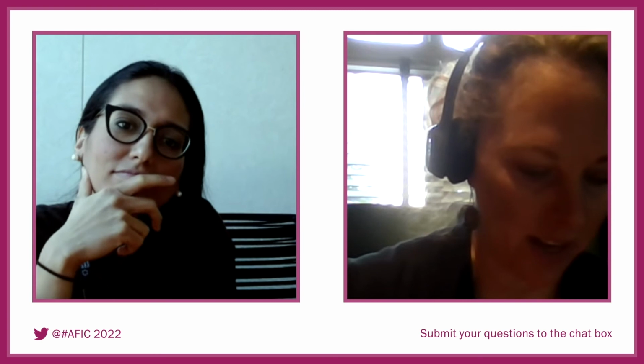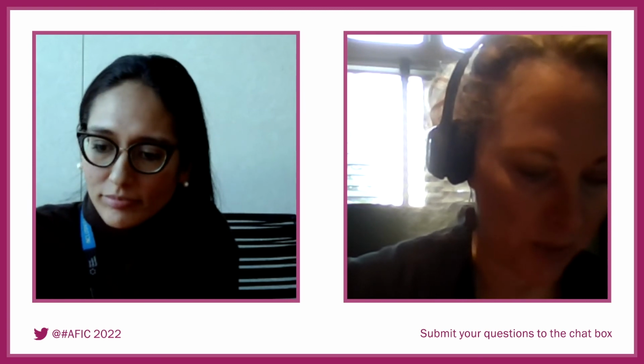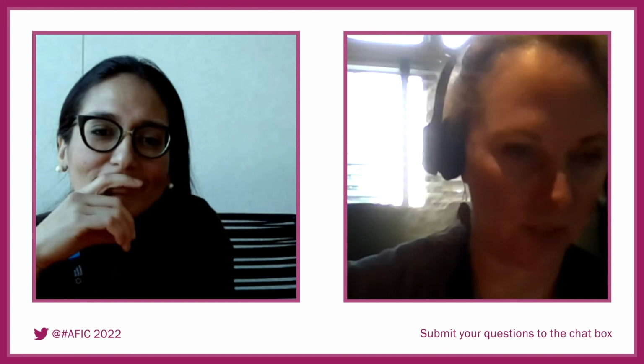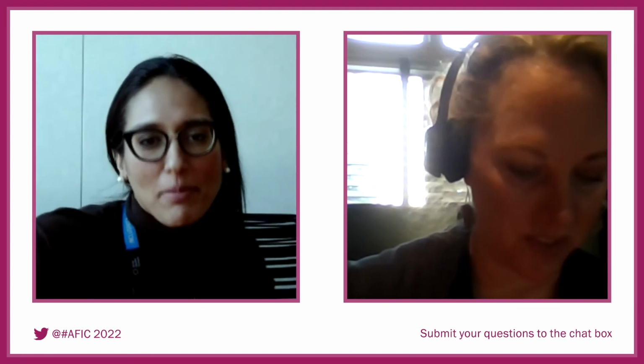I do want to move just quick to the CDH questions. One question was, do you trace lung circumference or area? I think you responded to that, but I don't know if you wanted to say more. Yeah, that's a question that's very dear to my heart because I spent my whole master's on this question.